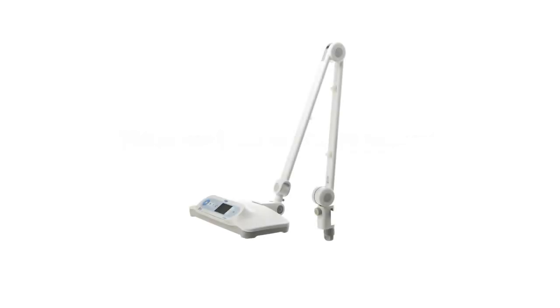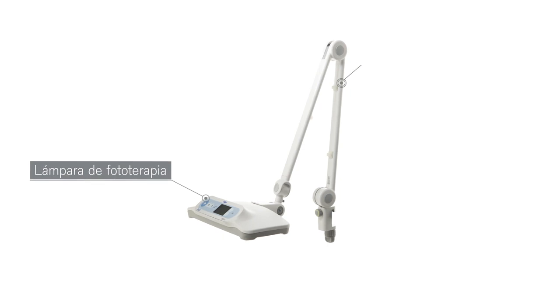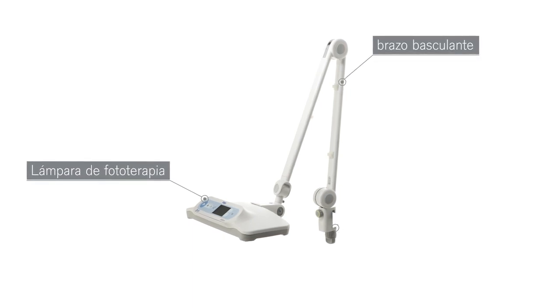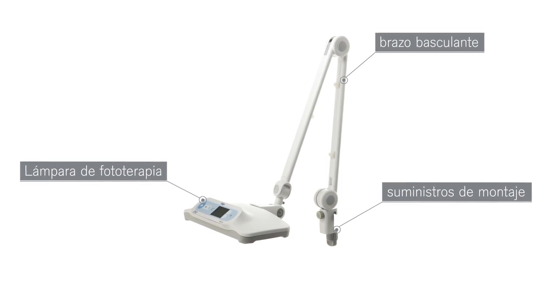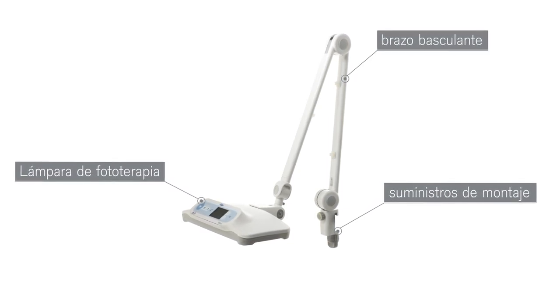The Bililux with spring arm consists of the phototherapy light, an adjustable spring arm, and mounting provisions that allow the Bililux to be used with various Draeger warming therapy devices and ceiling supply units.